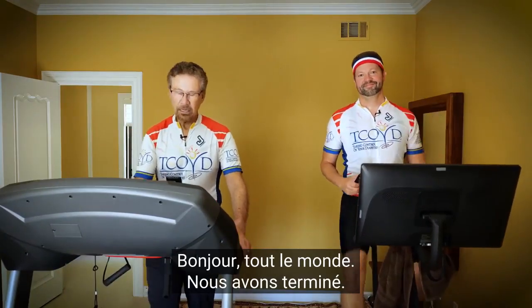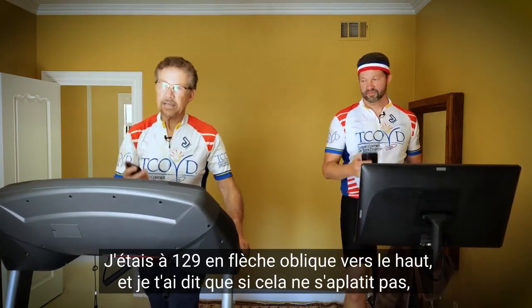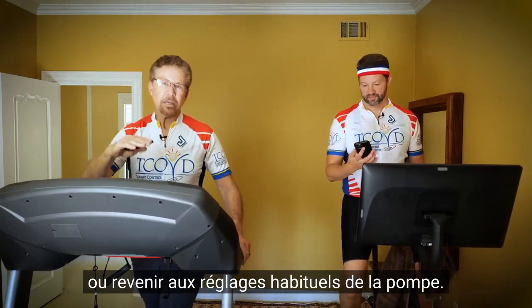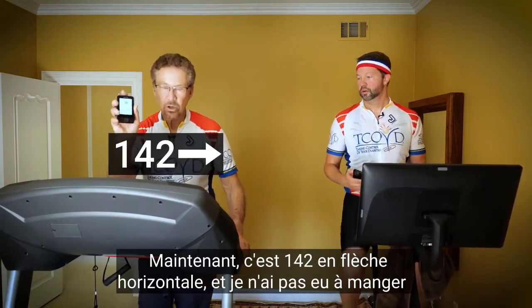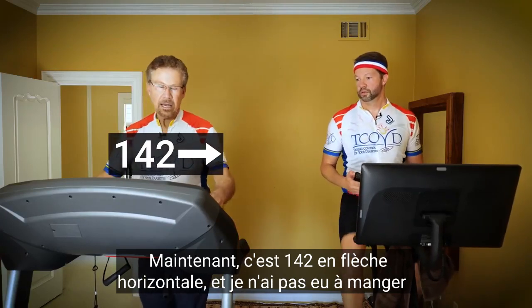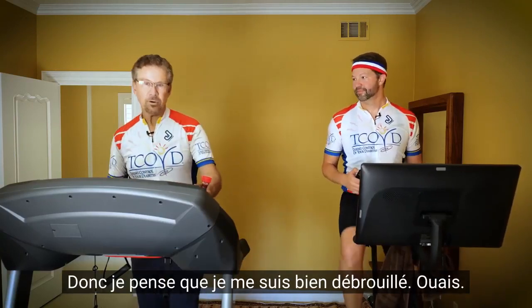Hello, everybody. We're done. I'm going first. Halfway through, I was 129 diagonal up. And I said to you, if it doesn't flatten out, I'm going to give myself a little bolus or go back to the regular pump settings. And it did. It went to 137 diagonal across. Now it's 142 straight across. And I did not have to eat any of my favorite low glucose snacks, goo and or shot blocks. So I think I did pretty well.